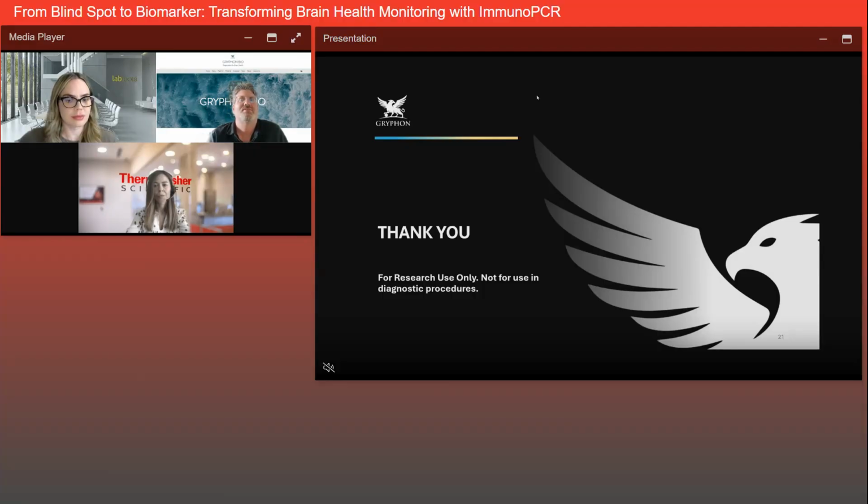And then, of course, there are lots of statistical and biophysical metrics we use to select good biomarkers. Is the assay capable of getting an LOQ in the single-digit picogram per mil level, for example? But also when we're calculating the area under the curve for predicting outcome, do the statistics show us that this really is a predictive biomarker? So I don't have something I can share, but I'd say there's at least 20 criteria that we use when selecting good biomarkers. And IP is certainly one of those criteria as well.